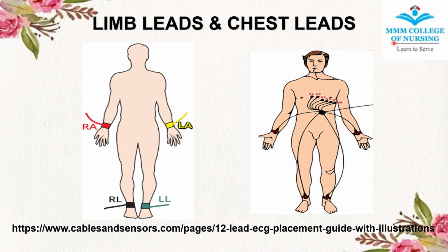For recording the limb leads, we will be using 4 electrodes placed over all 4 extremities, that includes right arm, left arm, right leg and left leg. From these 4 electrodes placed on the extremities, we will be recording 6 limb leads. And for recording the chest leads, 6 electrodes will be positioned over the chest, from which 6 leads will be recorded.